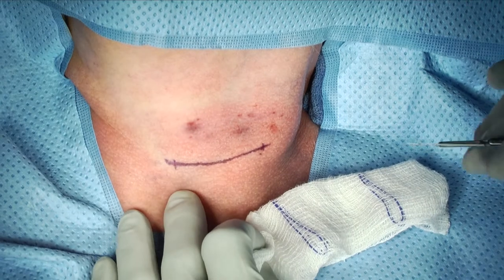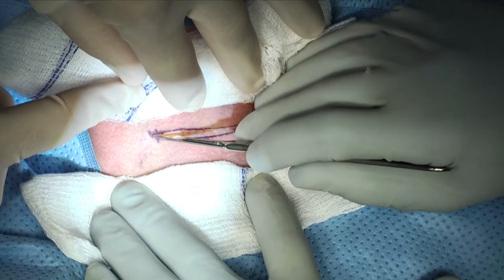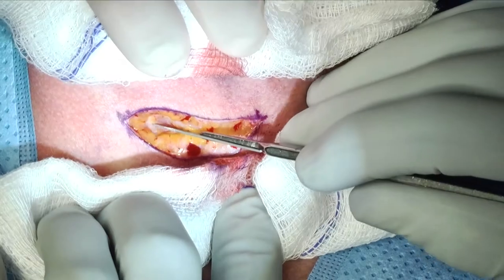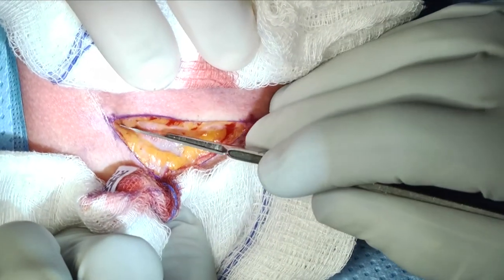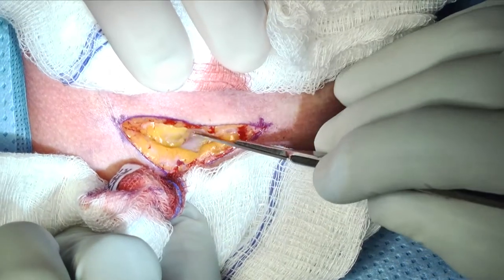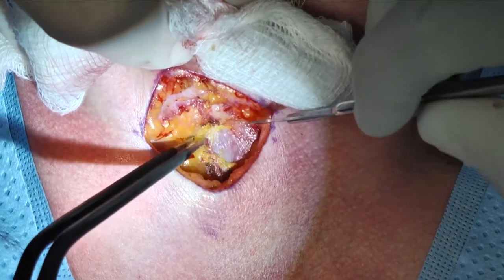We mark and draw out a line — about a four to five centimeter incision in the lower part of the neck. Usually I'm at the level of the cricoid cartilage, in case I want to do a thyroplasty and can move up. We go just about midline and then all the way to the sternocleidomastoid, going through platysma and then going through the deeper layers.